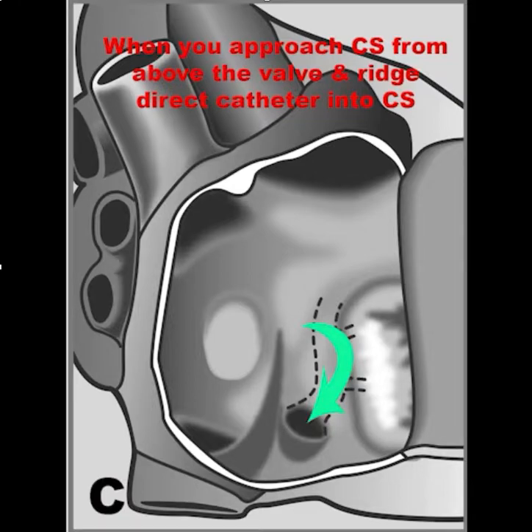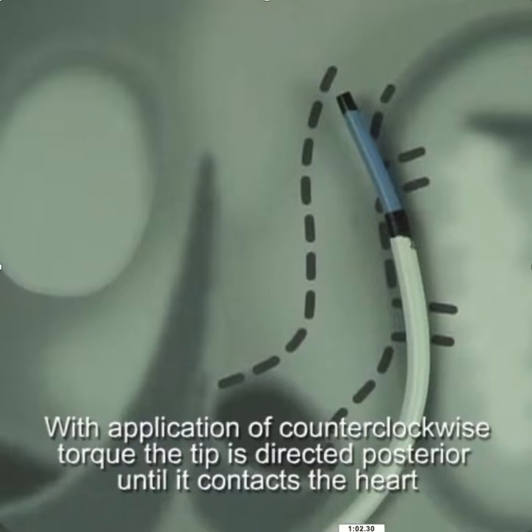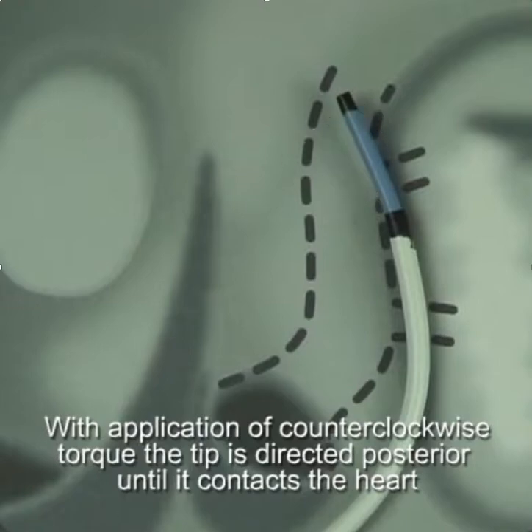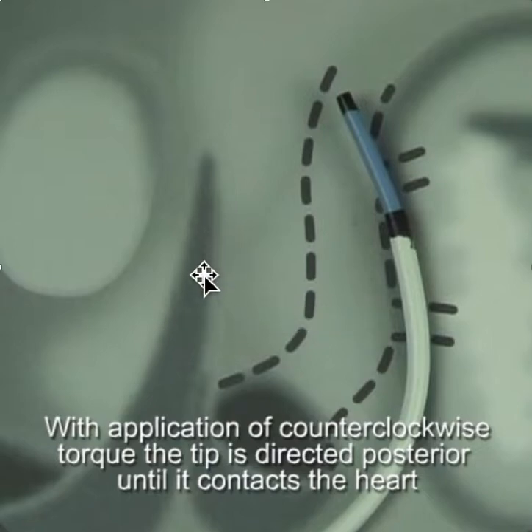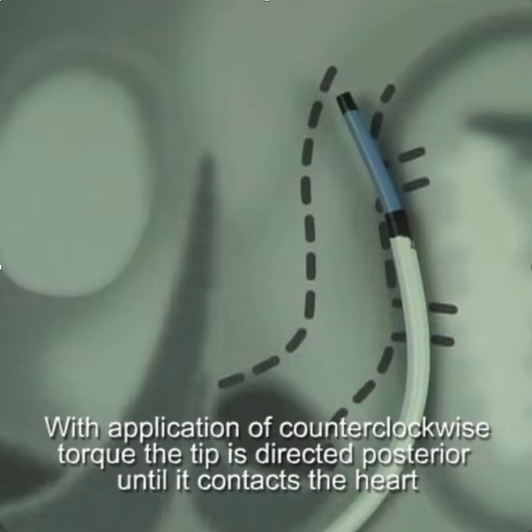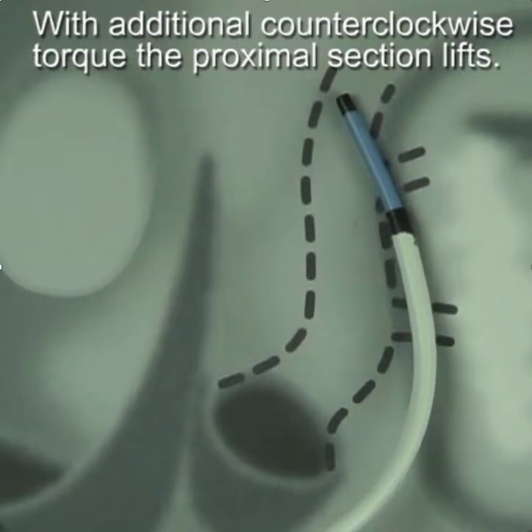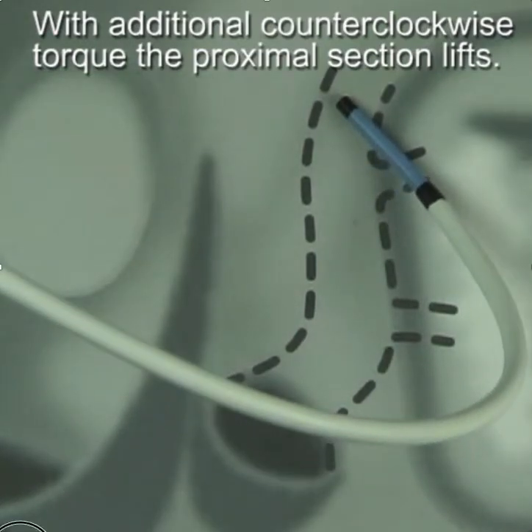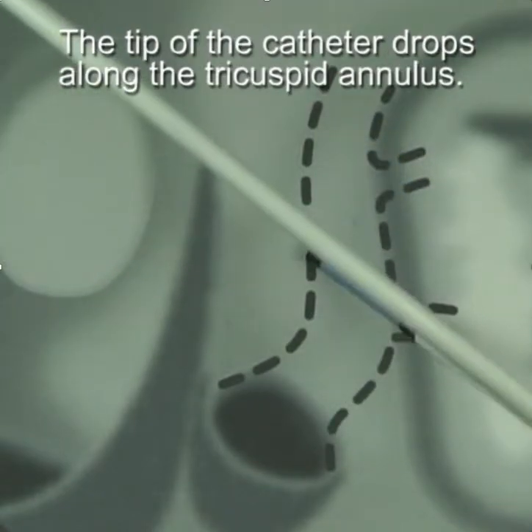So why is this relevant? If you use a catheter that has a large curve on it and the tip of the curve takes you above the coronary sinus and is on the ventricular side of the eustachian ridge, then when you apply counterclockwise torque, the tip will be directed posteriorly. With additional counterclockwise torque, the proximal section lifts up and the tip of the catheter drops along the tricuspid annulus.